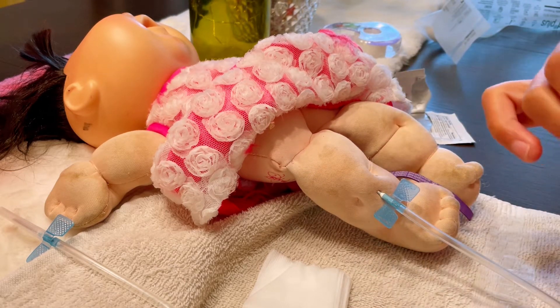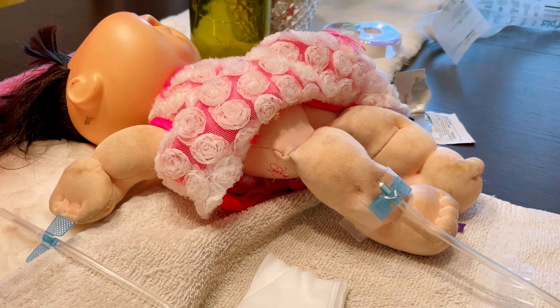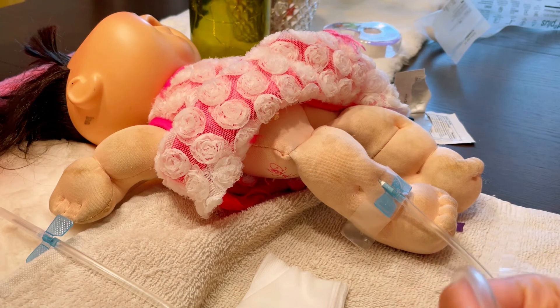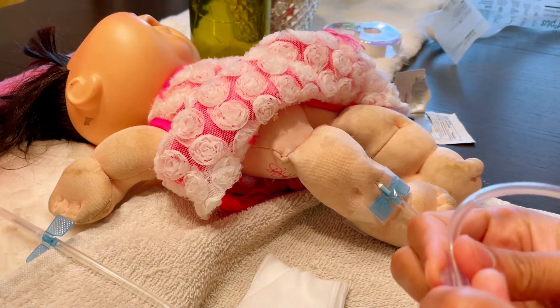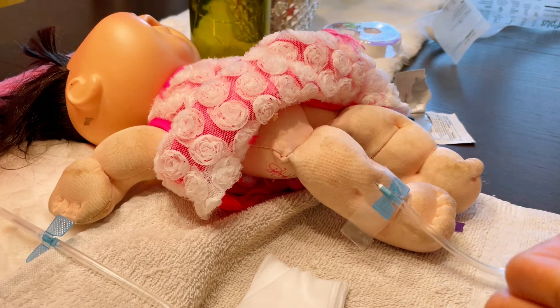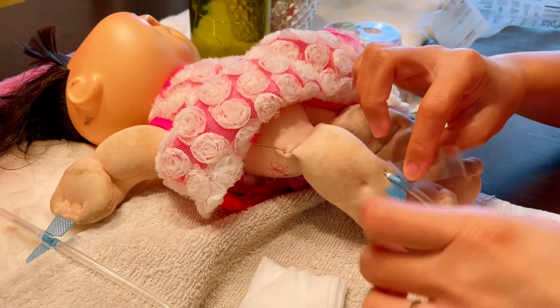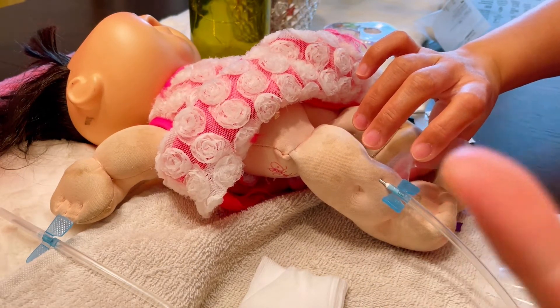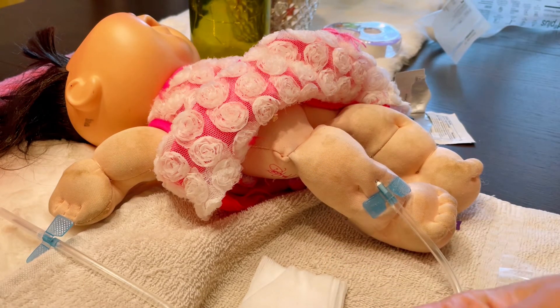Secure it with tape, but before applying all the tape, check the patency of the needle. If blood comes back but flow is weak, get a 10cc empty syringe and aspirate to see if there's resistance. If there is resistance, the needle is not inside the access — pull the needle back and check if the tip is touching the wall of the access. Adjust, then aspirate again to confirm you've got it right.